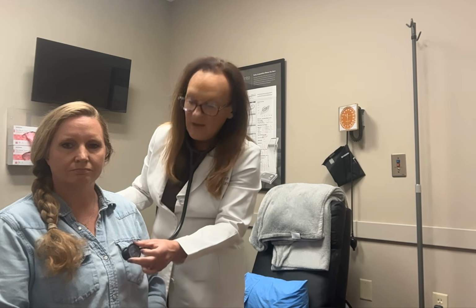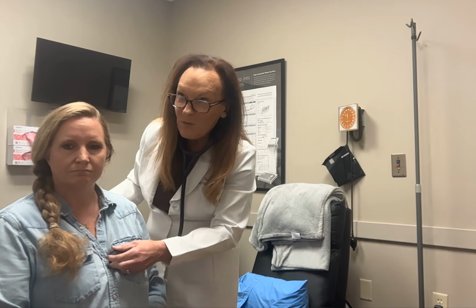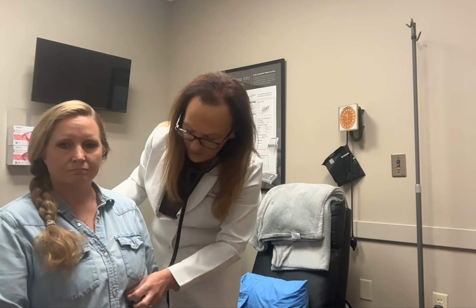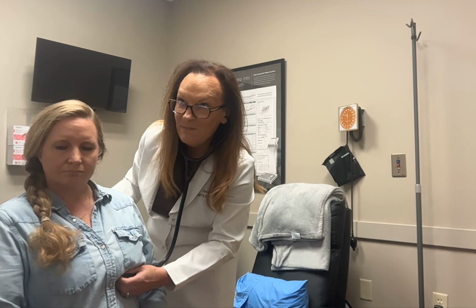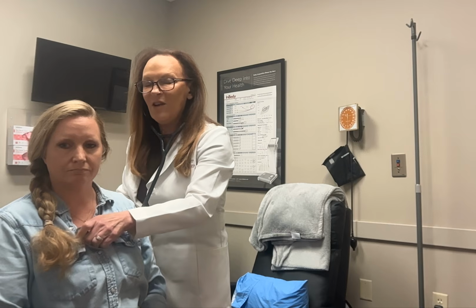We're going to check the tricuspid, which is the fourth intercostal space, left sternal border. And we're going to check the mitral, which is fifth intercostal space, mid-clavicular line. And we're going to switch and check everything all over again.